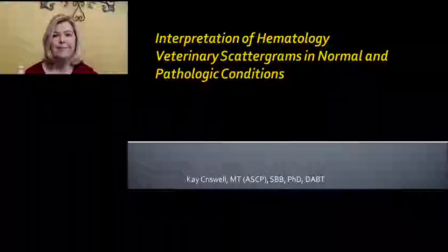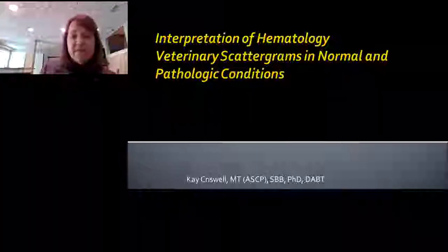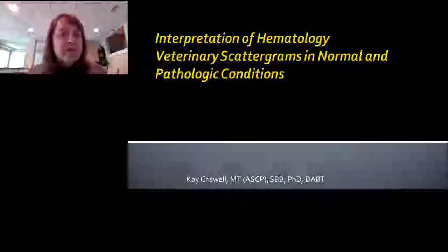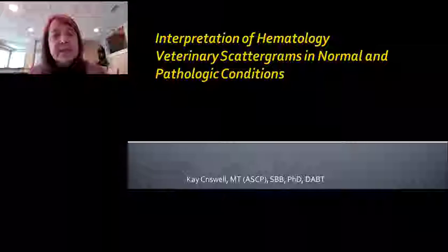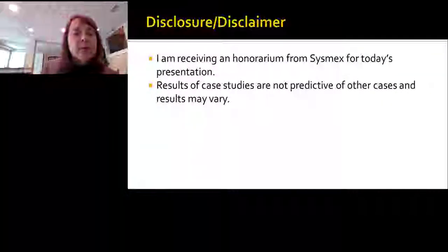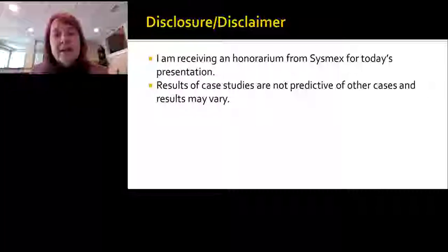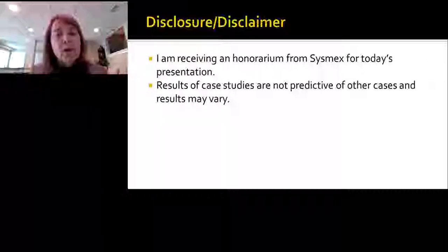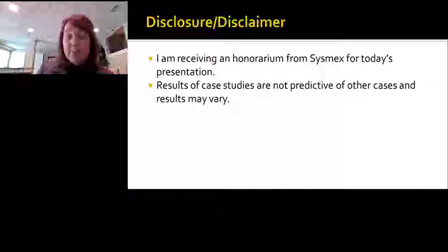Today's presentation will focus on the interpretation of hematology veterinary scattergrams. As a disclosure, I have received an honorarium from Sysmex for today's presentation. Importantly, we will be looking at a multitude of case studies, and it's very important to recognize that not all case studies are identical. Although we can use them as a good learning opportunity, one case does not necessarily predict the next.